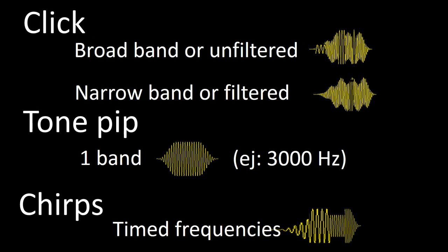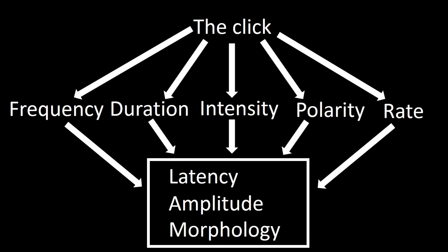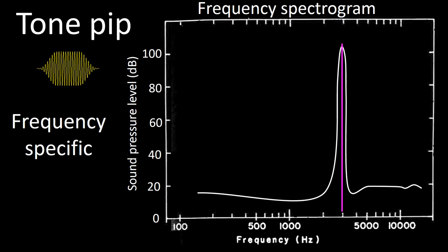Regular brain auditory evoked responses conducted by neurologists are performed using broadband clicks. These clicks have a frequency spectrum given by the manufacturer of the equipment and are not subject to change. Frequency, on the other hand, is very important and subject to manipulation for audiological testing. The stimuli used for audiological testing are called tone pips. They use a restricted frequency.